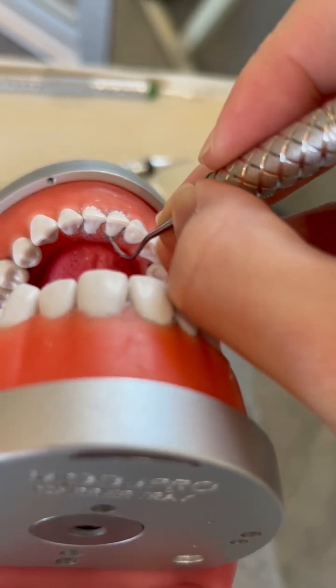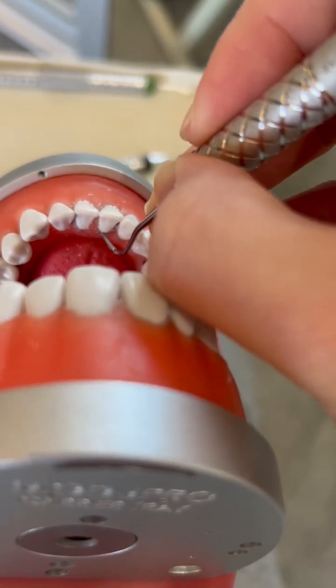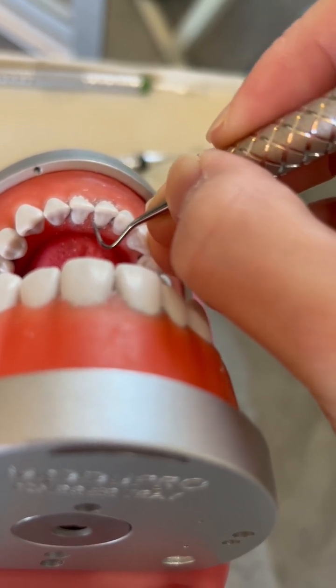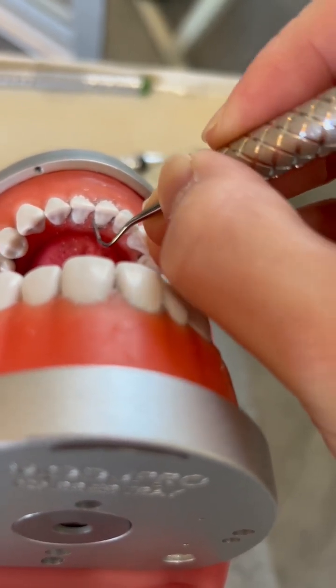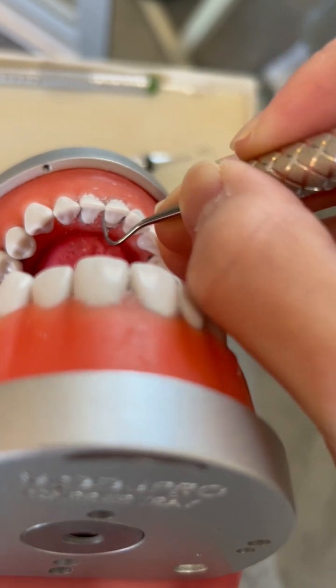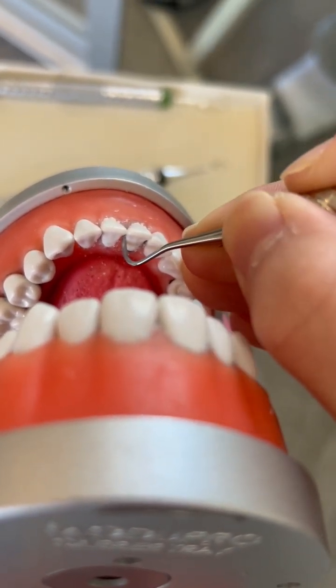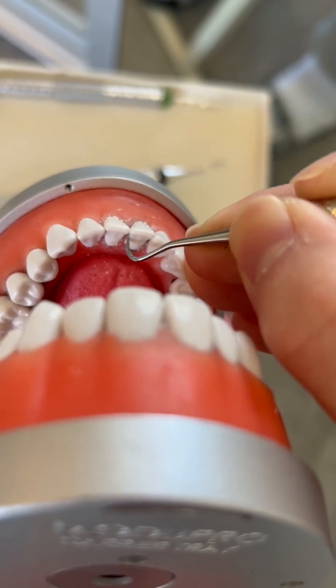Same with tool number 25. Start at the midline, side to side, pivot and roll, side to side, pivot and roll. Only go half of the interproximal space.